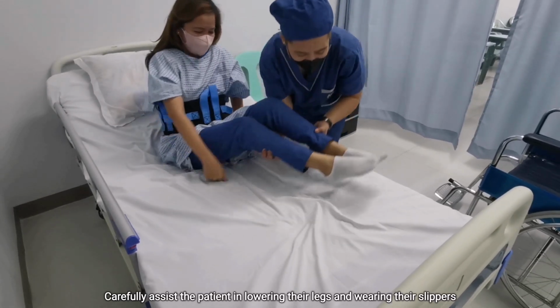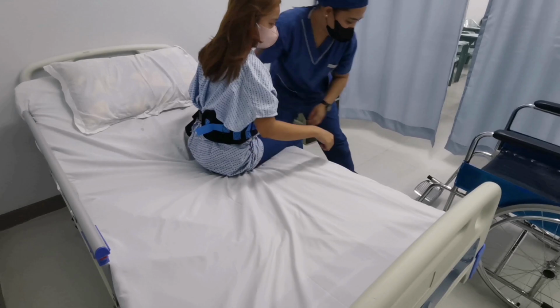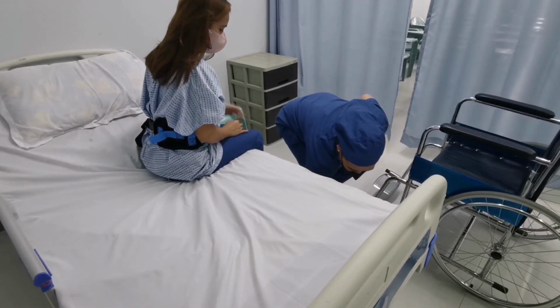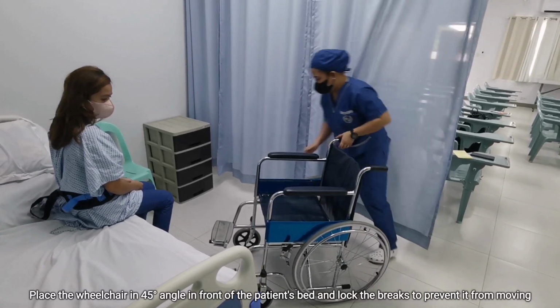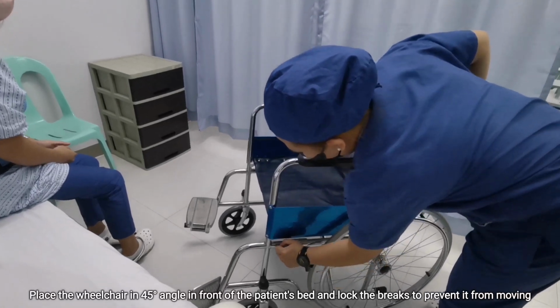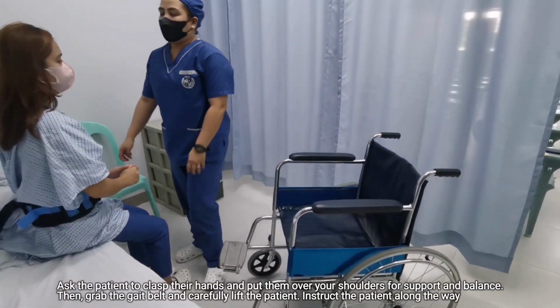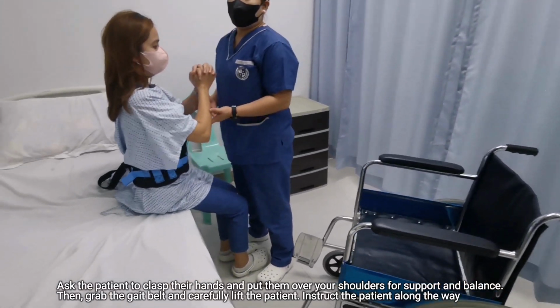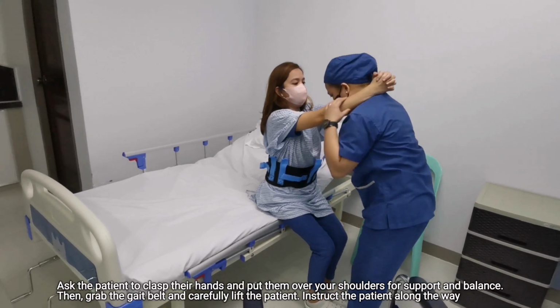Carefully assist the patient in lowering their legs and wearing their slippers. Place the wheelchair at a 45 degree angle in front of the patient's bed and lock the brakes to prevent it from moving. Ask the patient to clasp their hands and put them over your shoulders for support and balance. Then grab the gait belt and carefully lift the patient. Instruct the patient along the way.